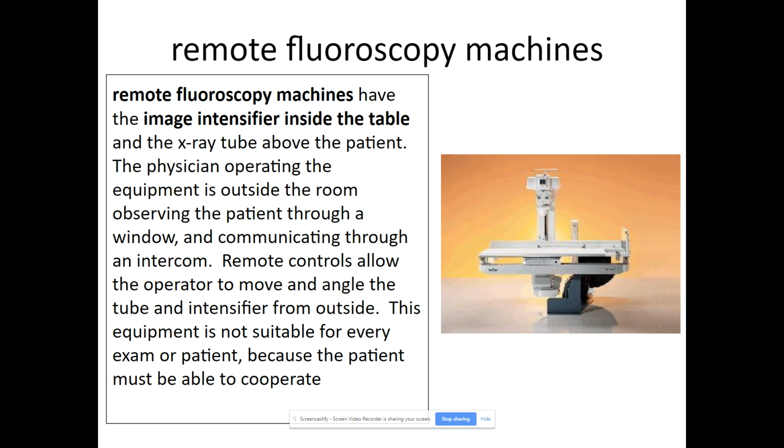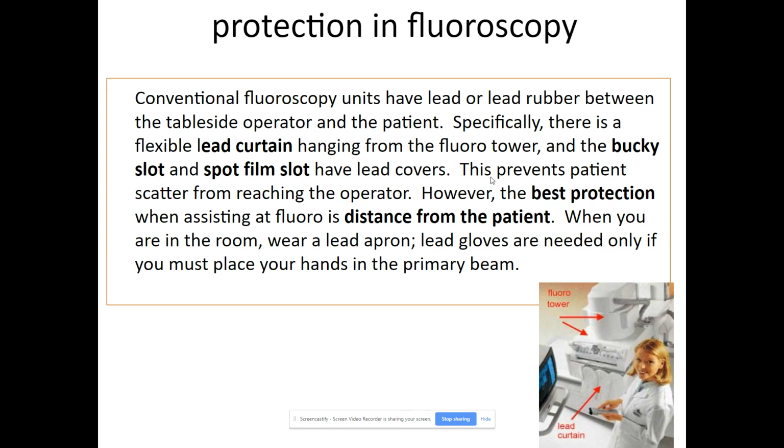It still comes under the definition of conventional fluoroscopy to me, right? Still using an intensifier tube, it's just in a different place, right? All those transitions that we talked about, that's all the same. It's just a different kind of operation in terms of protection, right?